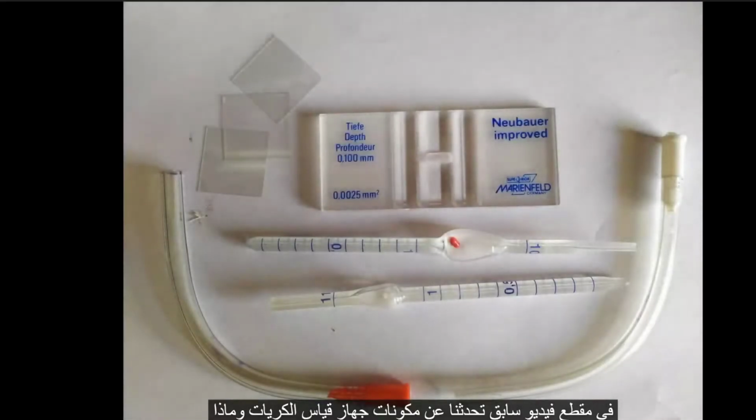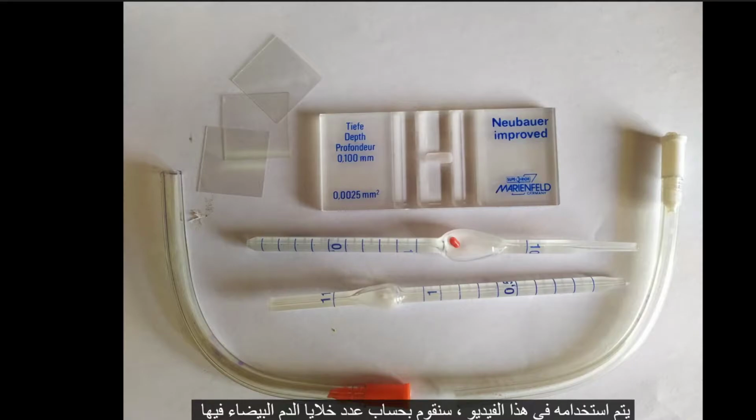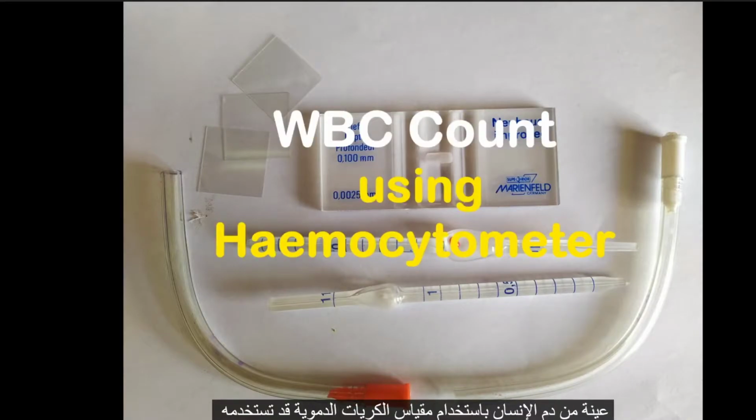In the previous video, we talked about the components of a hemocytometer and what it's used for. In this video, we're going to count the number of white blood cells in a sample of human blood using the hemocytometer. You may use blood from any animal to count the WBC population. Total leukocyte count, or TLC, is a more commonly used term for WBC count.